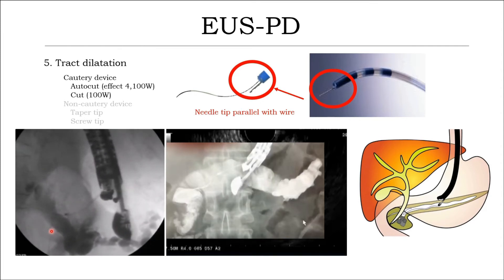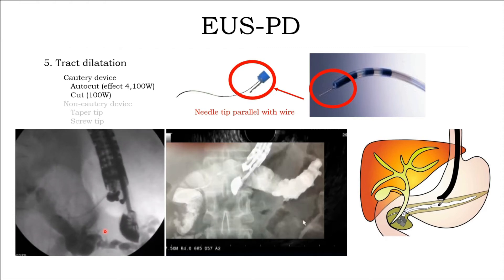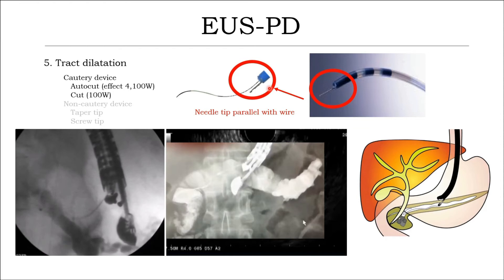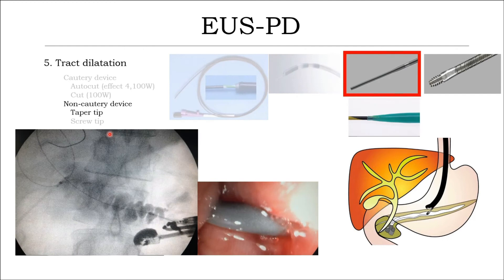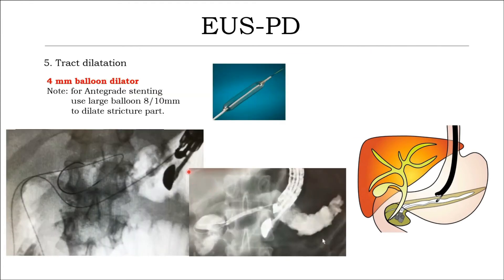When using the needle-knife, you need to open just half of the needle to keep the needle parallel with the guidewire — not fully open. In some cases, combined dilation with a tapered dilator is required, followed by dilation with a 4 mm balloon.